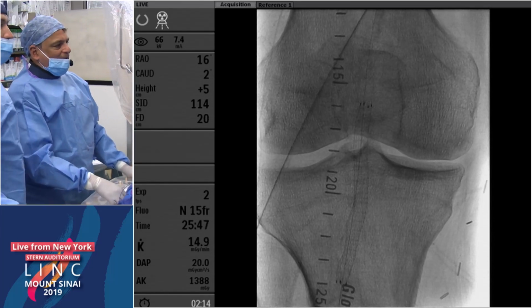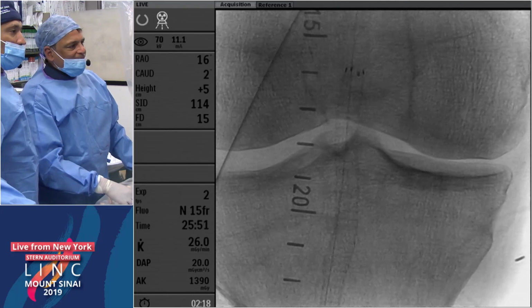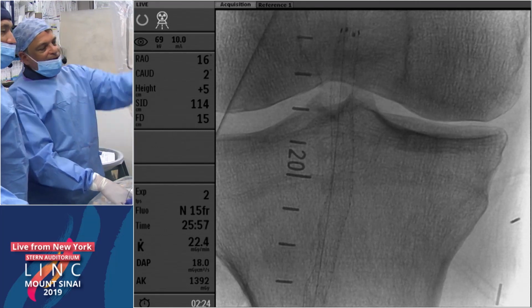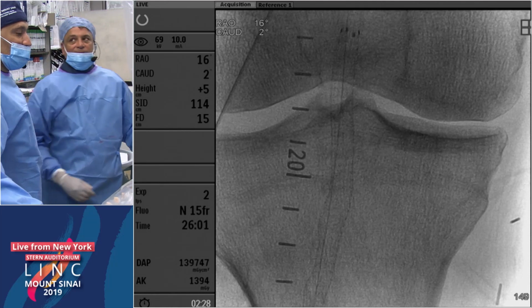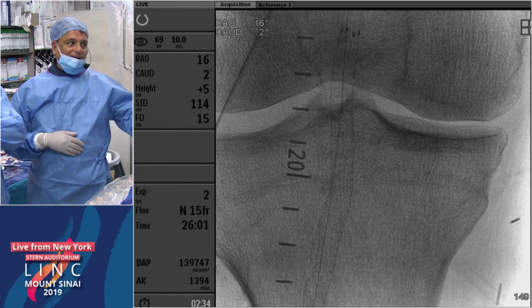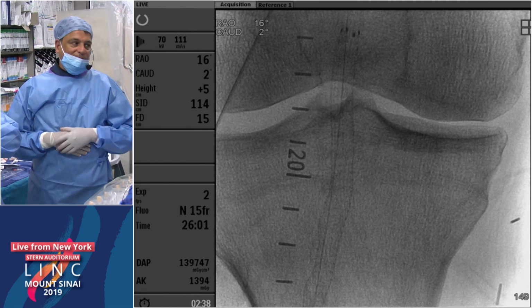this is what I always talk with Brian about, because we meet often. When the outline of that stent goes from flat to all of a sudden having a belly like mine, you can see that is the area I worry about, outpouching and then the pseudoaneurysm developing. So regardless, Mike, even if I had time in this case, with that kind of perf and that kind of belly, I would probably have stented it.